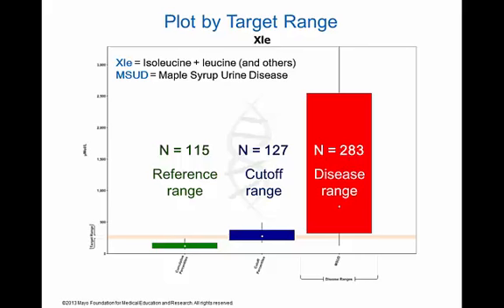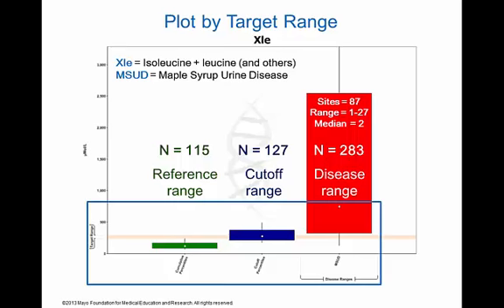The total number of true positive cases is 283. These cases have been uploaded by 87 different programs, each contributing between just 1 to 27 cases, with a median of 2 per site. The ordinate scale, the y-axis, of all R4S plots can be adjusted as needed. For example, changing the scale from the default level of greater than 3000 nanomole per ml to approximately 800 is done by a click of a mouse at the desired level.